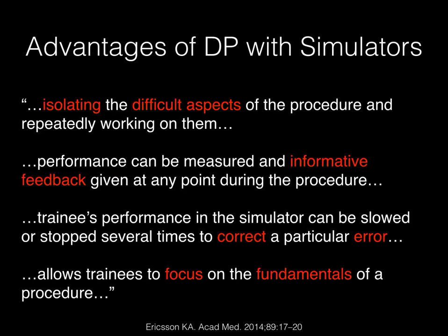You can't stop a surgery midway to give feedback to the resident necessarily, but you can stop that simulated scenario and give feedback right then and there on that procedure if need be. It also allows you to correct that error in real time as needed on the simulator. And it allows them to focus on the fundamentals of the procedure, not necessarily worrying about some of the other patient care issues related to a real world environment, but focusing on the simulator and that procedure.